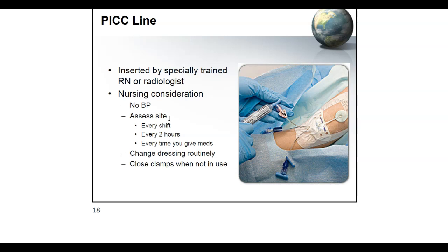Also, you have to change the dressing routinely. Follow your hospital policies. Commonly, central line dressings, including PICC line dressings, should be changed every week. Together with that, you need to change all the tubings, all the caps, as well as the dressings, whenever you do that. Because what's the purpose of changing the dressing when you're going to use the same tubing that you've been using the last week, right? So it doesn't matter, let's say you just changed the tubing yesterday, and the following day you are due to change your PICC line dressing, then you have to change everything at the same time. That helps prevent sepsis or infection in the bloodstream.